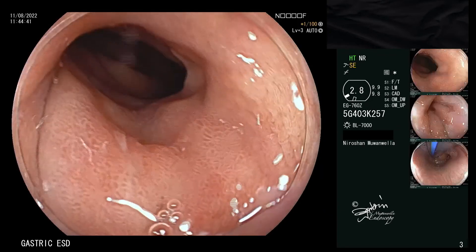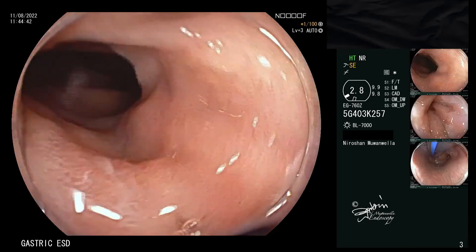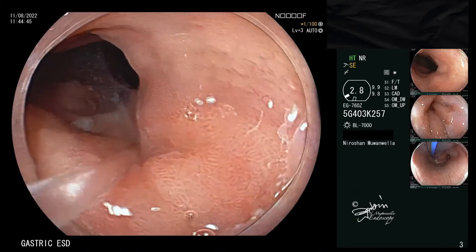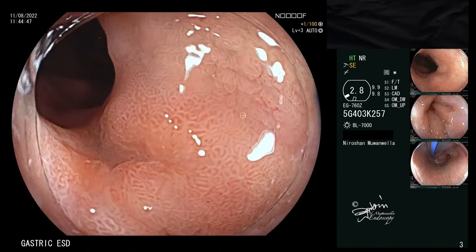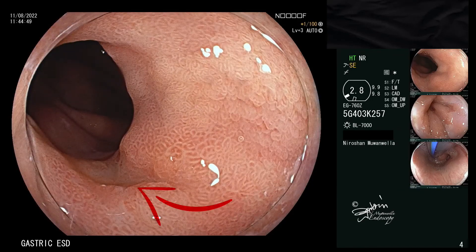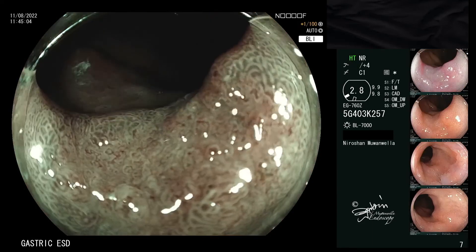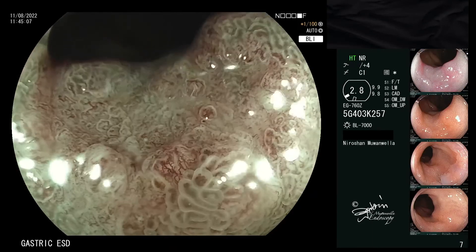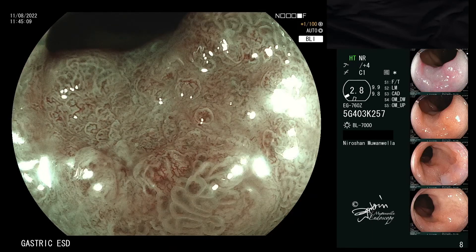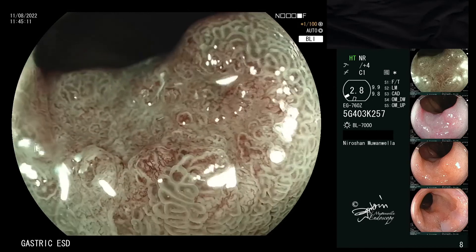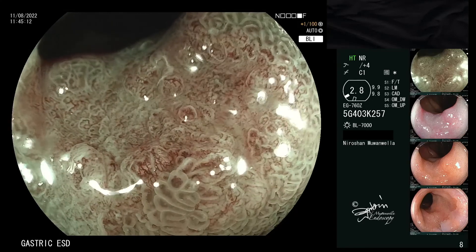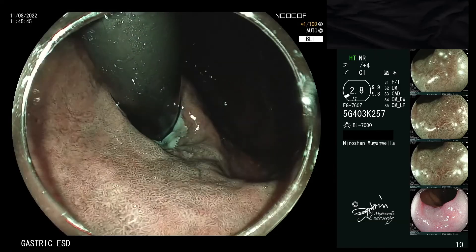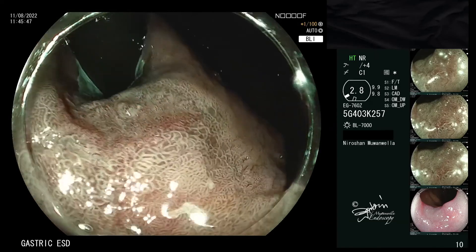Here you can see a slightly depressed area where an early cardiac malignancy is located. Zoom views demonstrate a clear demarcation line and dilated and disorganized vasculature. The lesion is better demonstrated in retroflexion views.